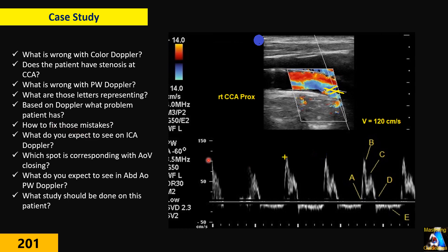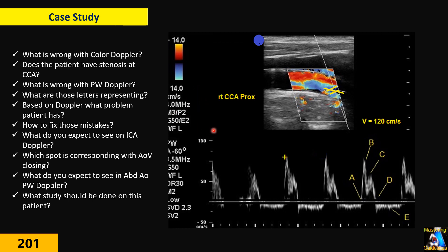How do you fix the mistakes that the tech has made? And what do you expect to see in the ICA — internal carotid artery — Doppler based on these findings?